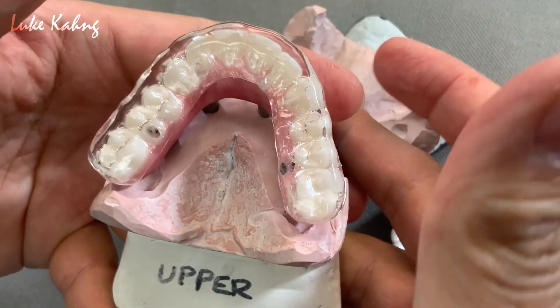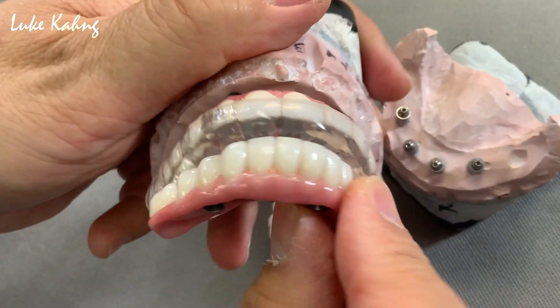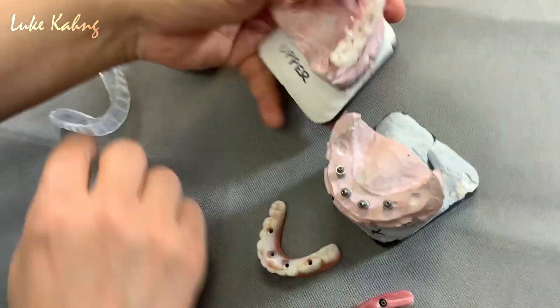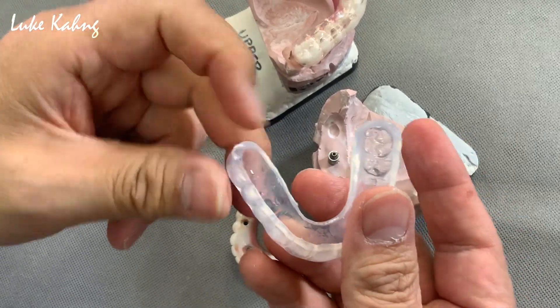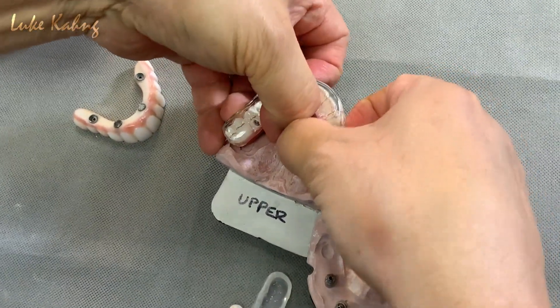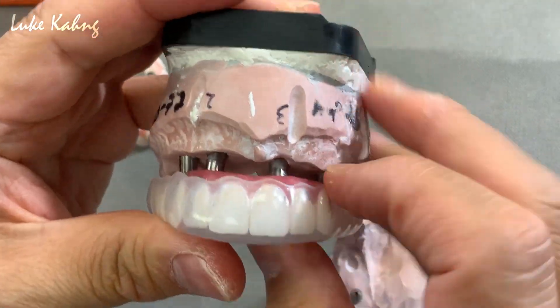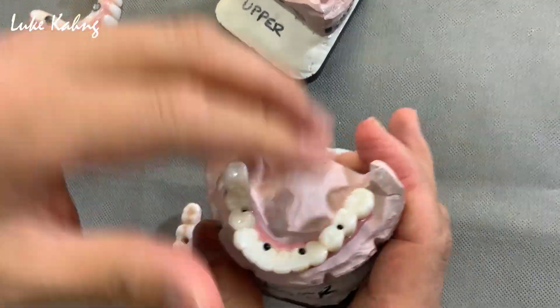So they can see it whenever they go to sleep — they look at it and can see the biting against the bite so it's protected. There's another concept as well — we also give them a soft one too, in case they prefer it. It's a nice fitting, so they can use one, two, three. They can use the soft one like that as well. This is another great case.